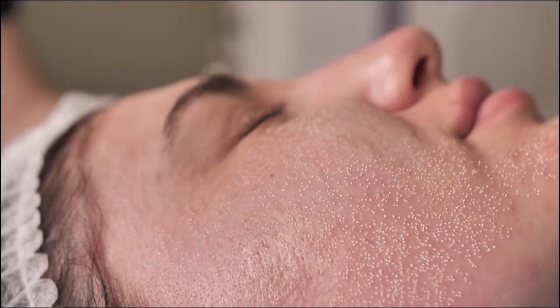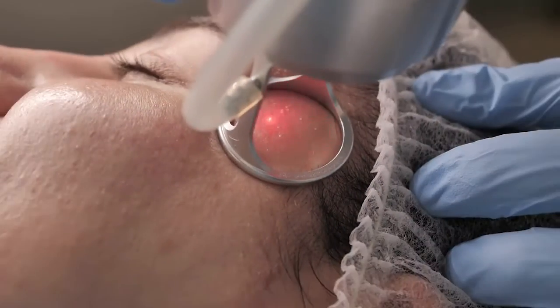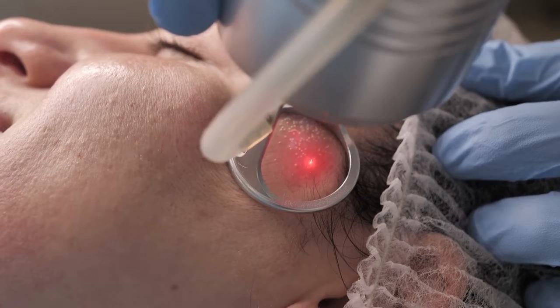So this whole area is going to build the superficial active effects. This is going to be the resurfacing. It's going to get rid of all those fine lines and wrinkles.